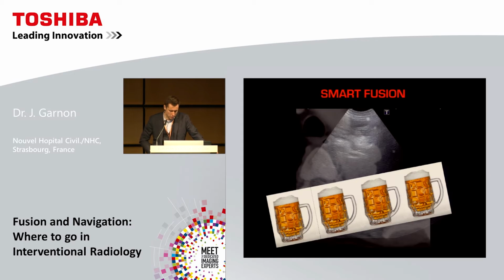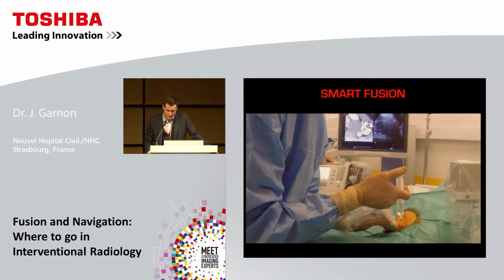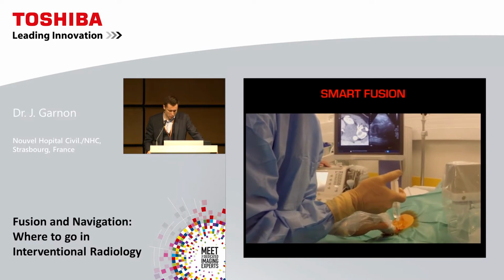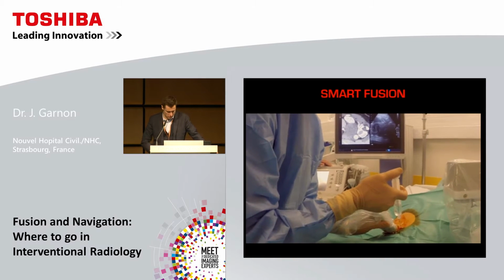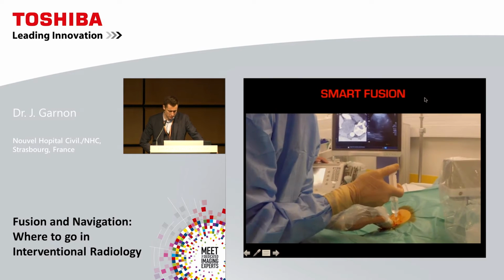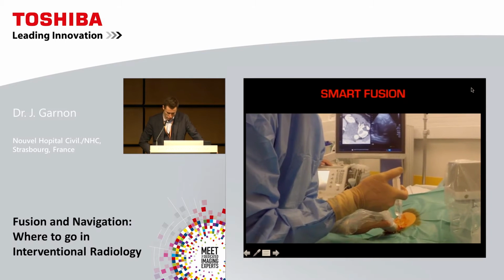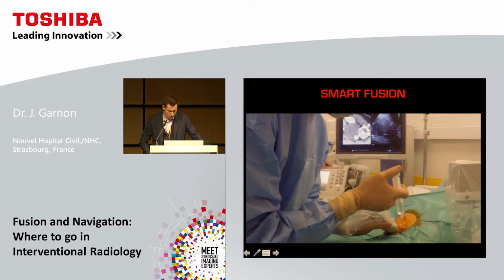There's a way to overcome the problem today. It's called smart fusion, and we have seen an example in the talk before. The machine will automatically synchronize the CT or MR DICOM images from a prior examination to the live ultrasound images. And this is how it looks during an intervention. You can see that we have covered everything in a sterile way. This was an adrenal biopsy. You can see here the CT images, which are perfectly synchronized to the ultrasound images, even though I'm not puncturing in a straight axial plane. So, a very useful tool. I will give you some examples a little bit later on.